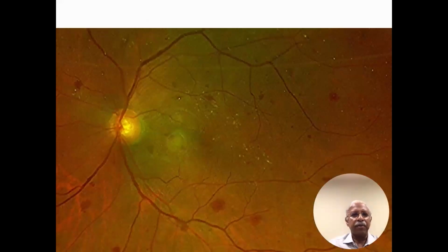So when you have a patient with background diabetic retinopathy like this, it is useful for us to document this. And when the patient comes back after 6 months or 1 year, we can show whether it has got worse or remains the same, and emphasize to the patient that he or she has to undergo further evaluation. Any other treatment such as anti-VEGF injections or PRP can be explained, and the patient can be educated in a way that he or she can understand completely.